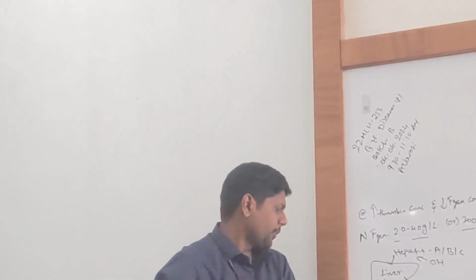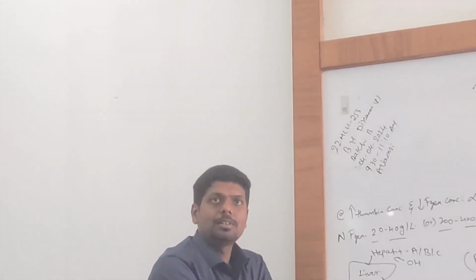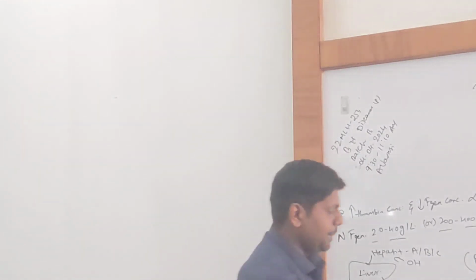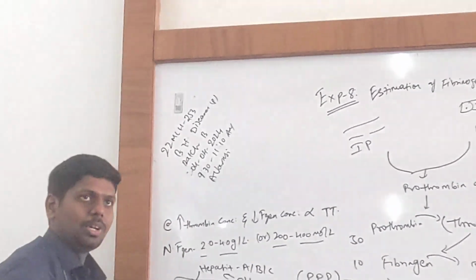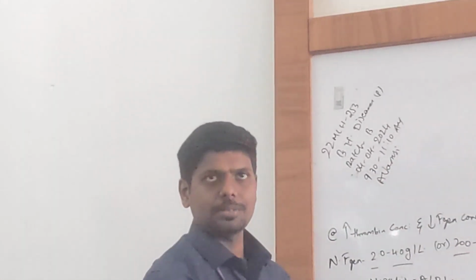Say for example, in qualitative, I came to know the patient has fibrinogen. Now I need to measure the levels of fibrinogen. That will be possible in quantitative analysis. Levels of fibrinogen can be studied in quantitative. Hence, this is a quantitative test.